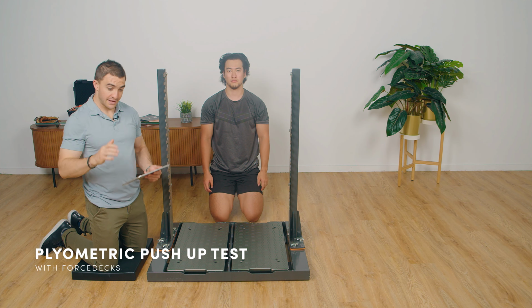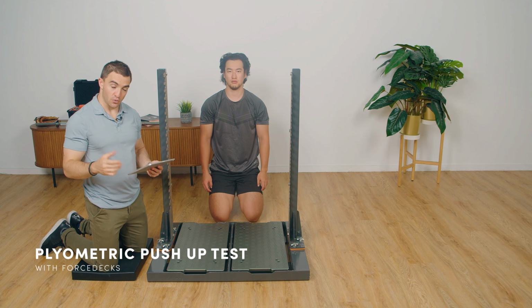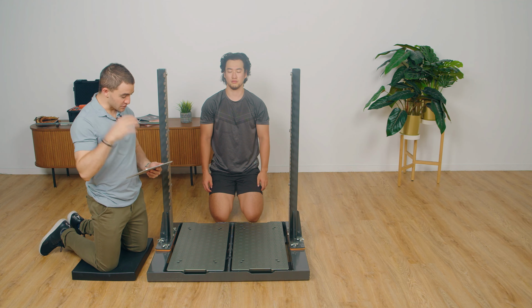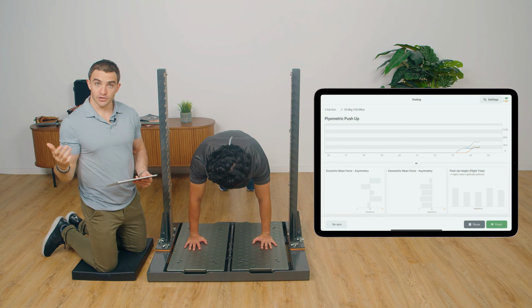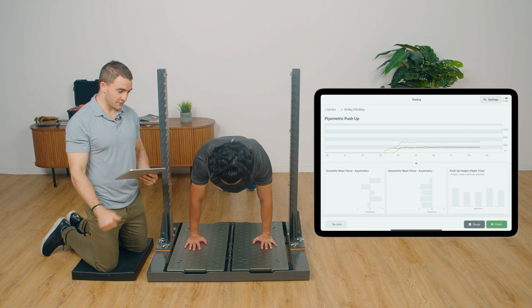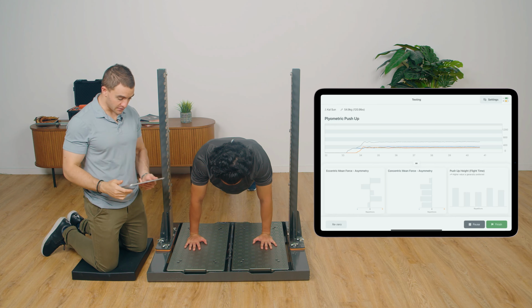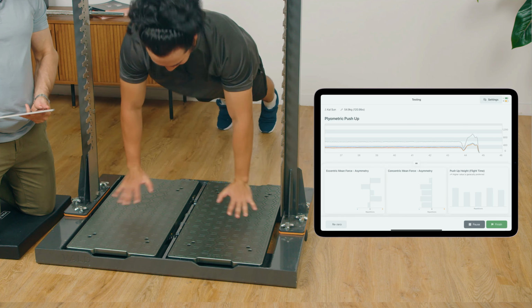We've looked at an iso push-up with max strength. Next thing we want to look at is max power, so we can implement a plyometric push-up. So Cal, when you're ready, go ahead and hop into push-up position. Now you can vary your cues with this. Usually what I tell my patient is I want you to do a push-up as hard and as fast as you can, fly into the air as high as you can, and land nice and steady. All right? Cal, when you're ready, go for it.